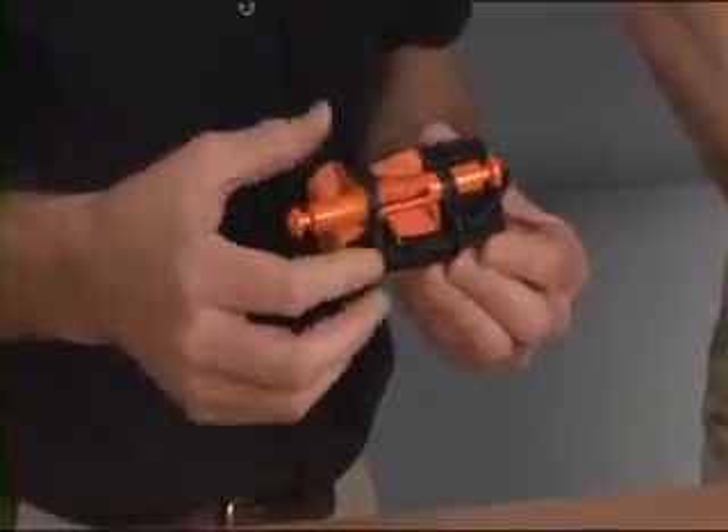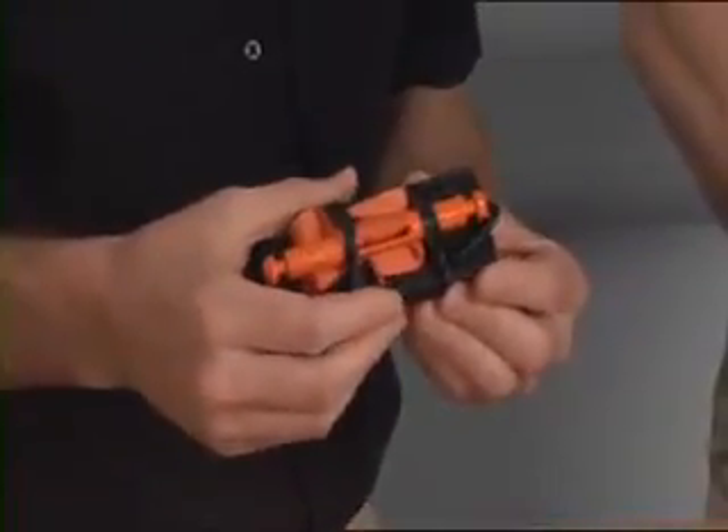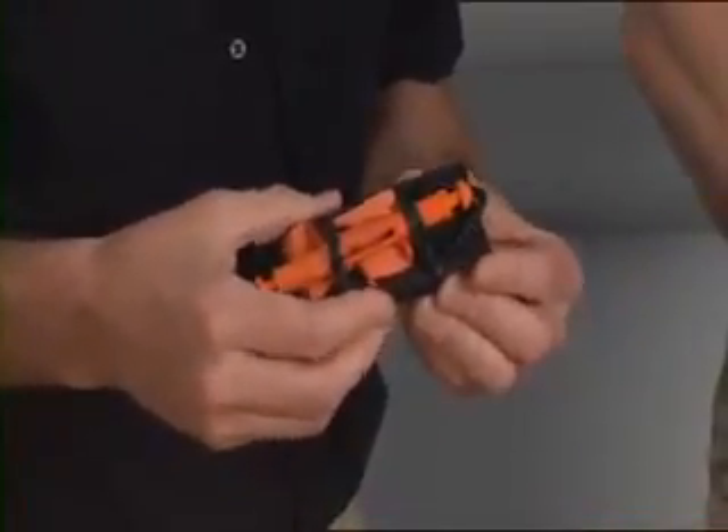There are a number of tourniquets that are commercially available. The Soft TW is favoured because of its robust construction, being made with a metal bar and with a metal buckle, and because we know it works.